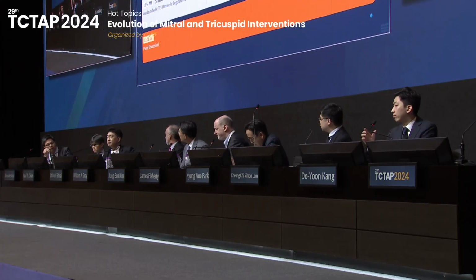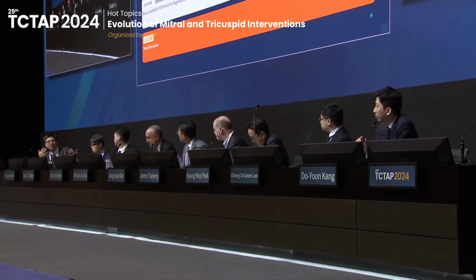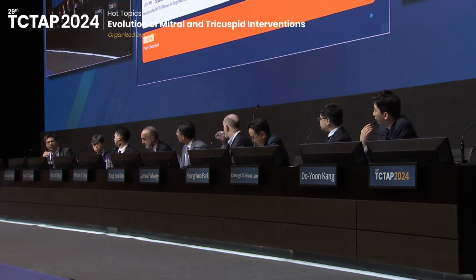After fully closing, we cannot see the leaflet, and we cannot assess how much leaflet is in the clip arm. So I usually check before closing the clip. Once the clip is closed, it's difficult. Can't tell.